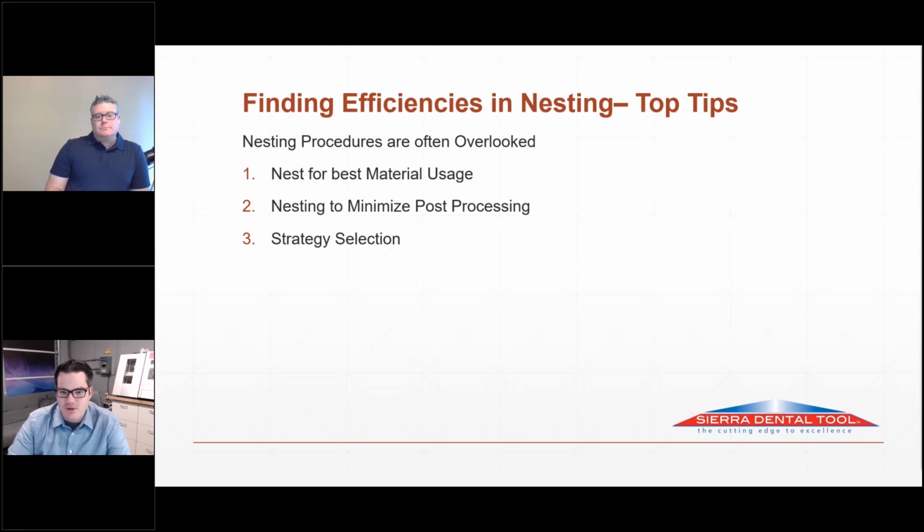But this is the low-hanging fruit here. If you nest certain ways, you can make better use of your material. You can cut down on your post-processing, and that all comes down to how you're doing the nesting job, how you're feeding the machine, and also your strategy selection and how that's all set up.